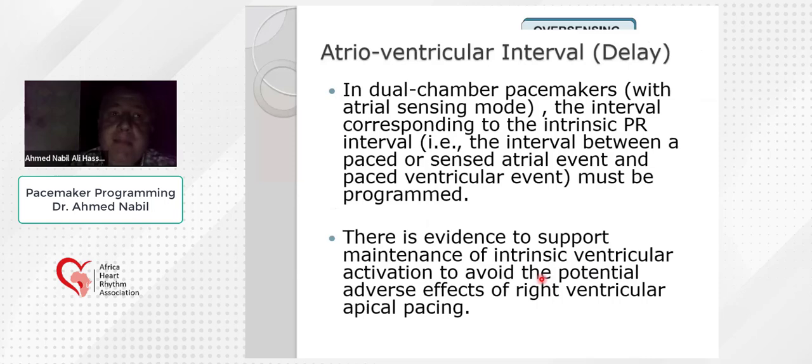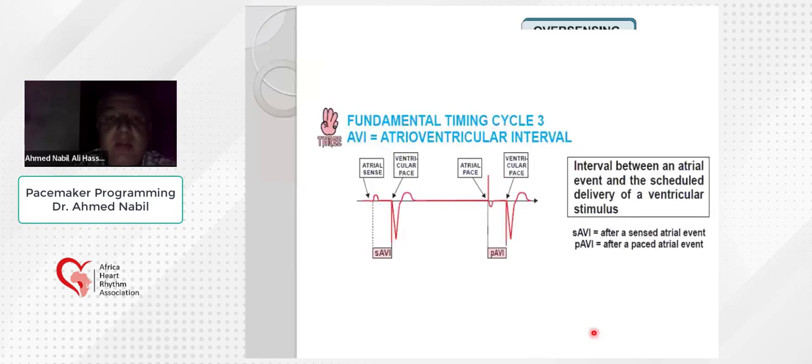First, to adjust the timing interval and the physiological timing intervals between the two chambers. And it is very important also in maintaining intrinsic ventricular activity if possible. If we have an intrinsic activity or intrinsic conduction, and there is a possibility of avoiding pacing, one of the tools that I can use is the AV delay, because I can give a bit longer AV delay to permit the intrinsic conduction if there is a possibility for that.